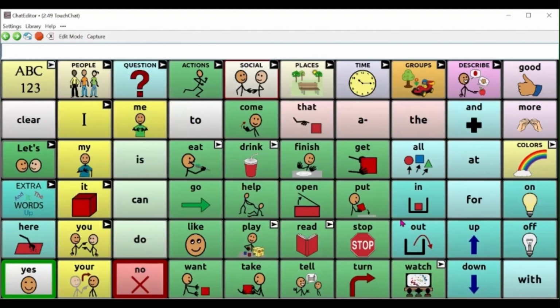So these core vocabulary words make up 80% of what we say, and they're very consistent across different languages. Everybody uses the word help universally. Everybody says they want to eat. They're consistent across different age groups and different cultures as well too. These words are often the sight words that your children will be learning as they're learning to read. And so they say if you learn the 220 sight words, you would be reading at a second grade level. So we're introducing them to literacy skills early as well.